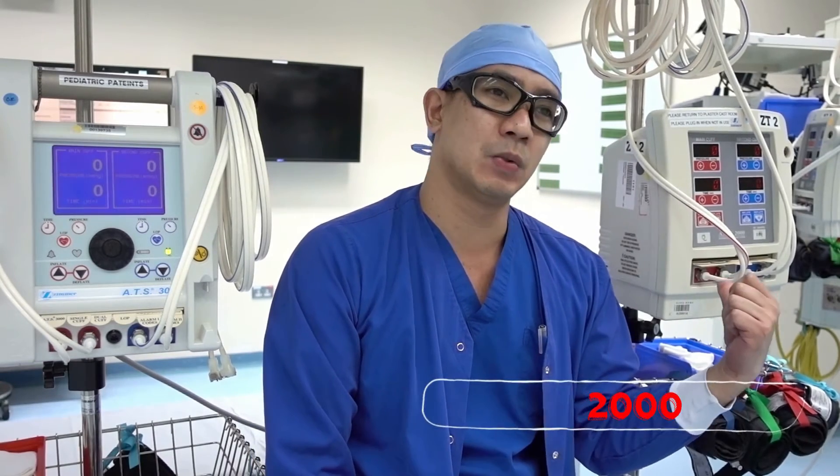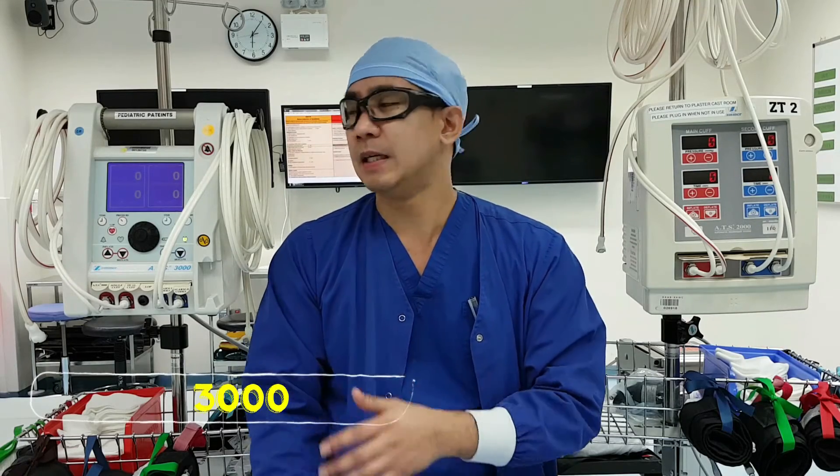In our facility we have the Zimmer ATS 2000 and the S3000. For the purpose of this video, we're going to talk about the S3000, how to use it, and its physical features.